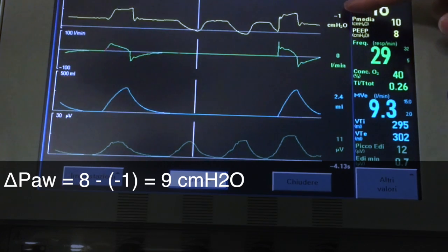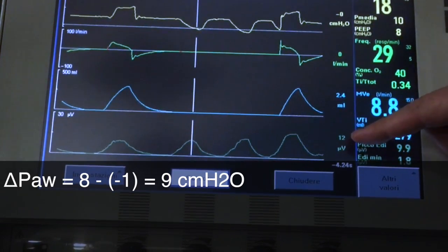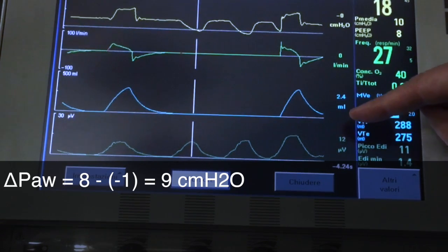In the same effort, we then see how much electrical activity the diaphragm spends to generate the pressure, and it is, in our case, 12 microvolts.